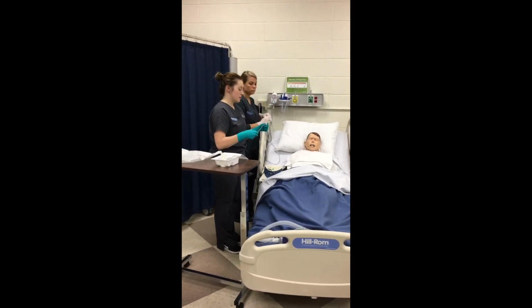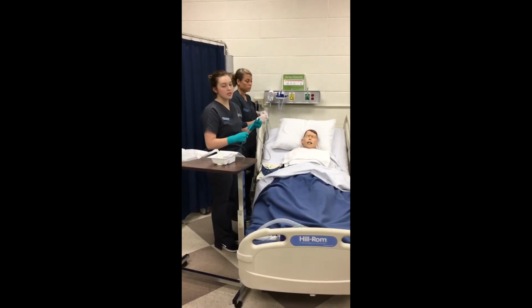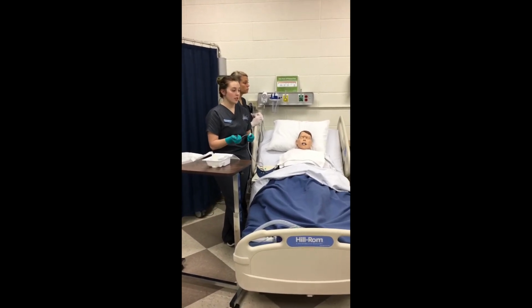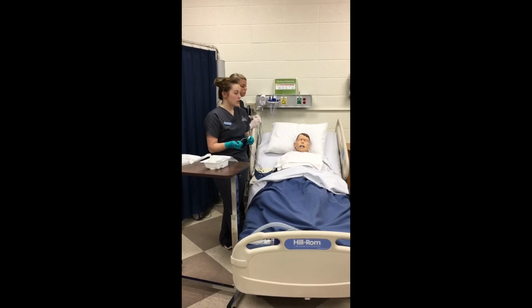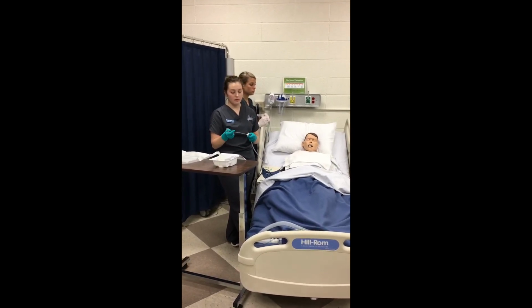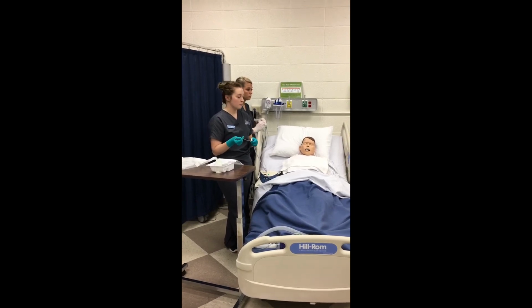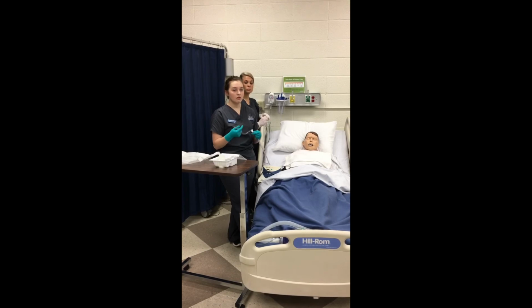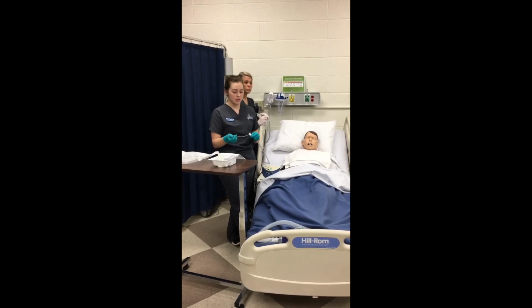Once the suction has been completed, you want to reassess your patient for any further signs of congestion or need to be suctioned. If there is another need for suctioning, you can re-lubricate the tip of your catheter and wait 30 seconds to a minute between suction times, but don't let that go over a span of 5 minutes.